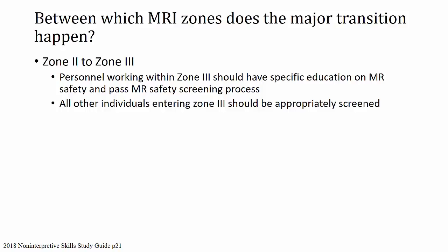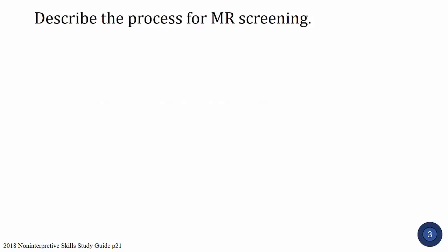That's the purpose of it, is to prepare patients, or anyone, to enter into zone 3, make sure they're screened, make sure you've taken care of everything you need to in zone 2 before they go into zone 3. Next question, describe the process for MR screening.